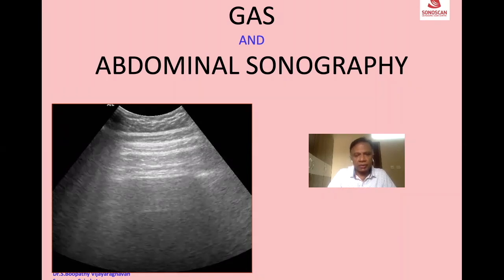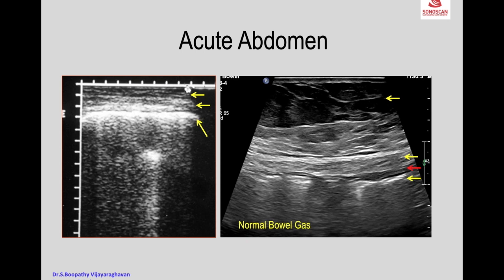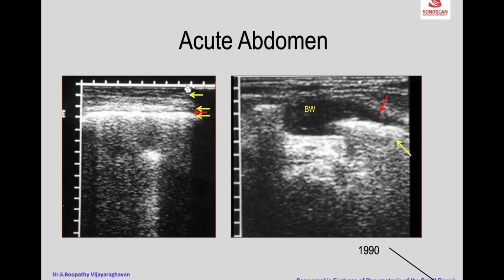This is a preview showing all the layers — subcutaneous fat, the muscle — and you see the long echogenic line of gas, as opposed to the broken gas pattern we see normally. This is a very long line. This case kindled my interest in the gas patterns in the abdomen, and that is the outcome of this lecture. We will see the various situations where gas is useful.